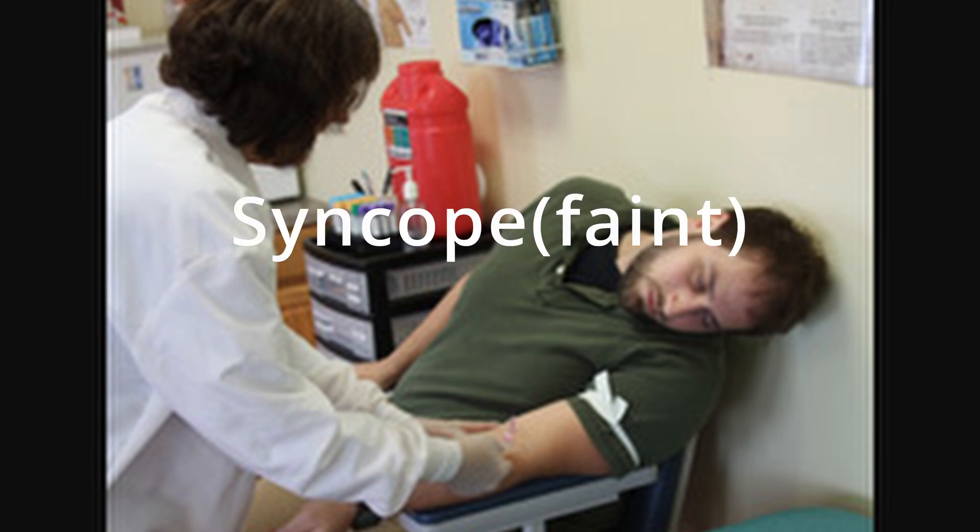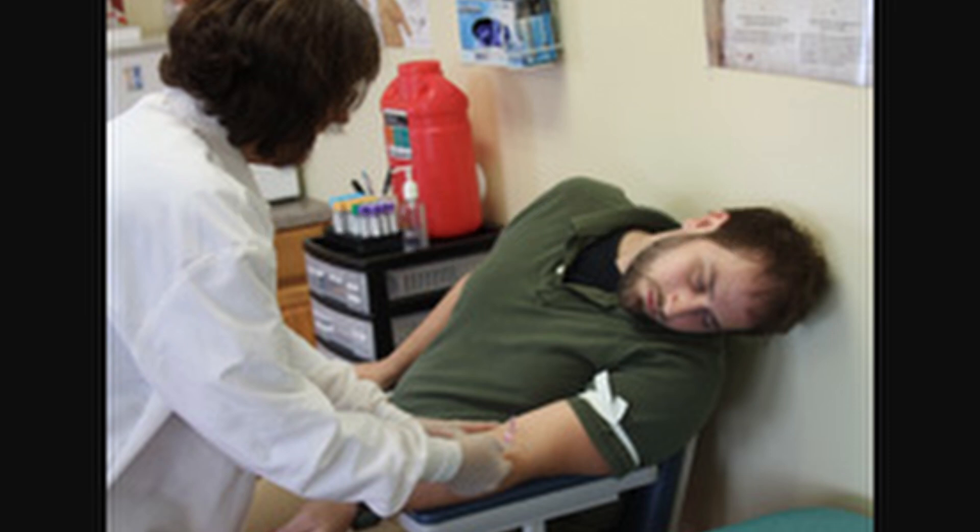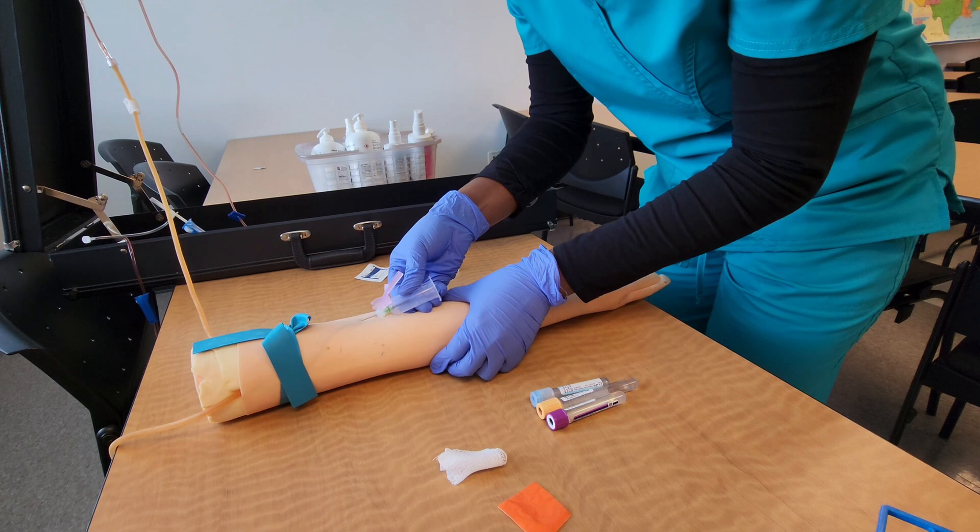Some patients have a history of fainting during blood collection, and this is something you want to be aware of so you can prepare yourself in case the patient actually faints. Prior to blood collection, you can have the patient lie on the bed or sit in the recliner so you're prepared to catch or break their fall. Also keep in mind: if a patient faints, the first thing you must do is immediately release the tourniquet, remove the needle from the patient's arm, and activate the safety device.